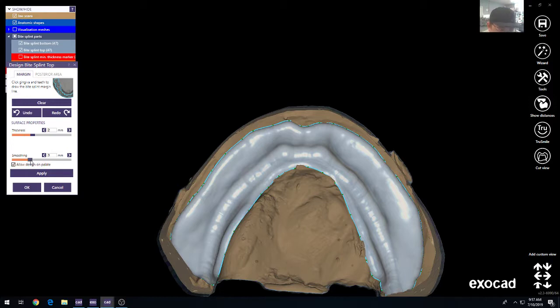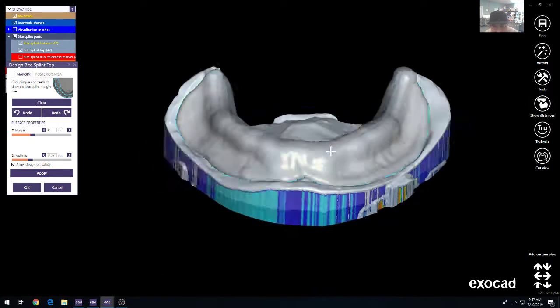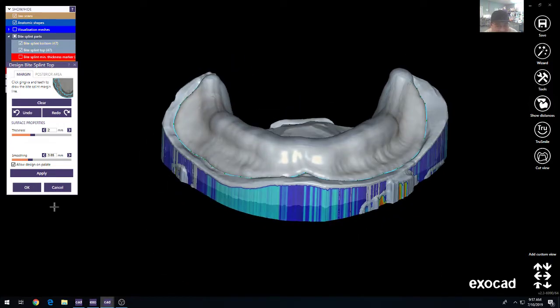So if you wanted to duplicate the natural rugae, you would go to minimal. If you want to go up, you would just go up. You then press OK, apply. I already have it, so I'm going to just press cancel.